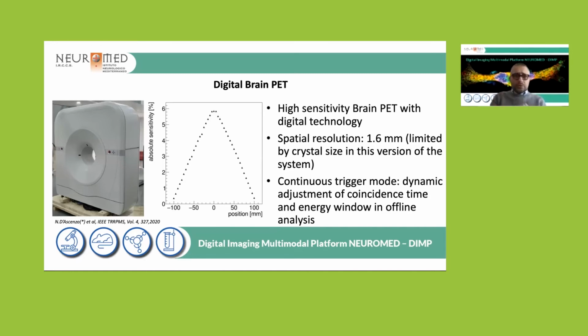It has a spatial resolution, which in this specific prototype is approximately 1.5, 1.6 millimeters. That's limited by the crystal size, mainly in this version of the system. It's not a limitation of the technology at all. It can be done in continuous trigger mode, so dynamic adjustment of coincidence time and energy window in offline analysis. This brings the sensitivity to a quite high and competitive level, and this is all what we need for good dynamic imaging of the brain.